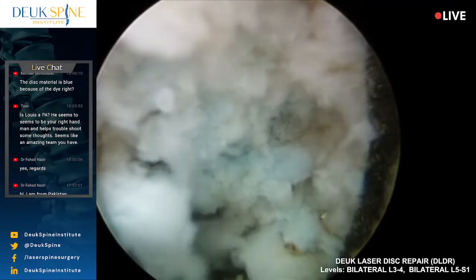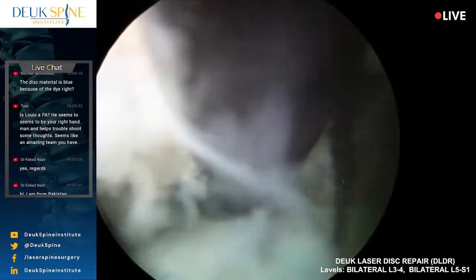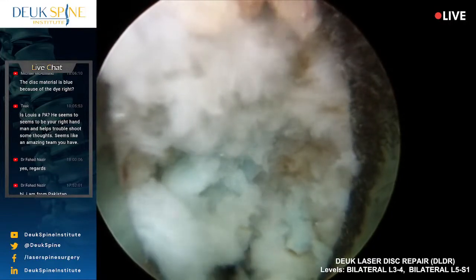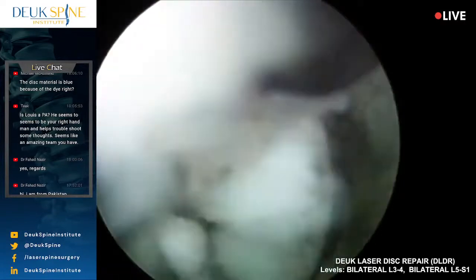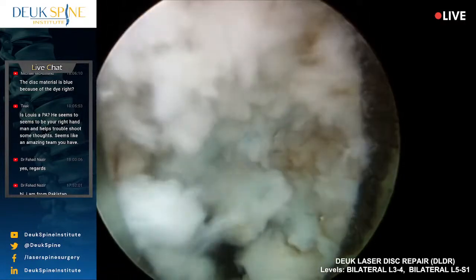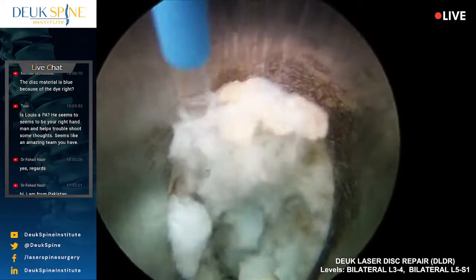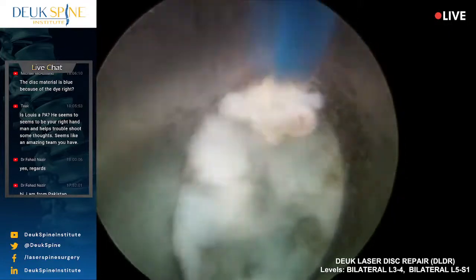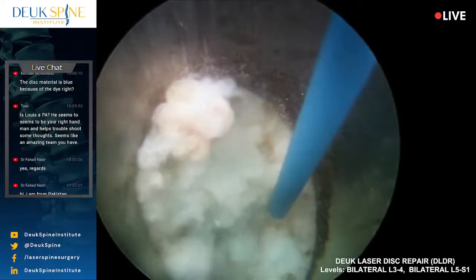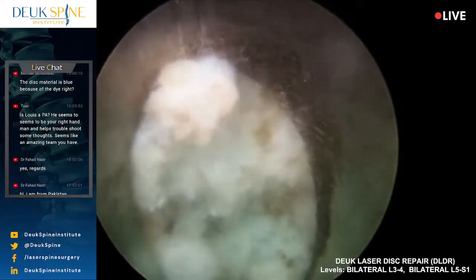Oh my God. This disc is the never-ending herniation. Honestly, I've never had so much, and you have to grab quickly. It's just a quick grab. Take it. We're going to be here till midnight if we don't get something done here. He's responding a little bit. Yeah, he's coming up.